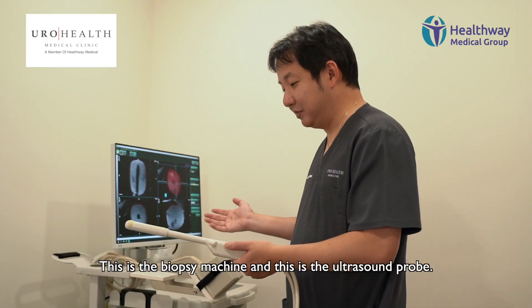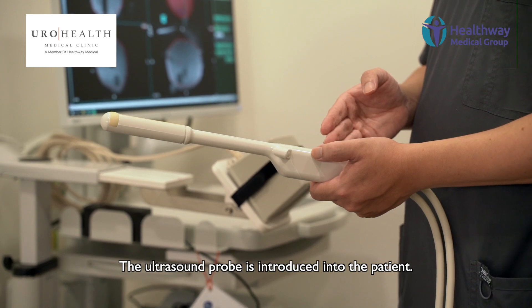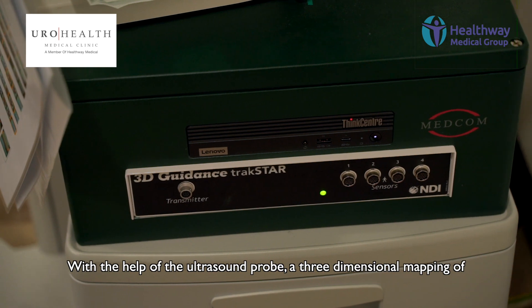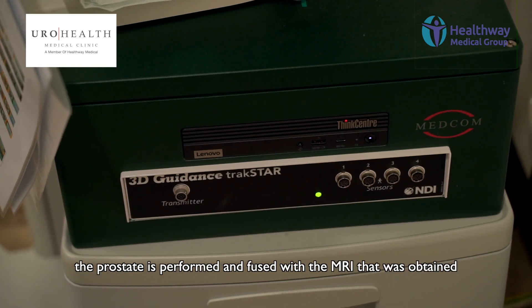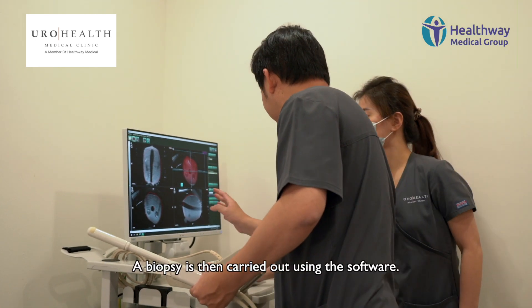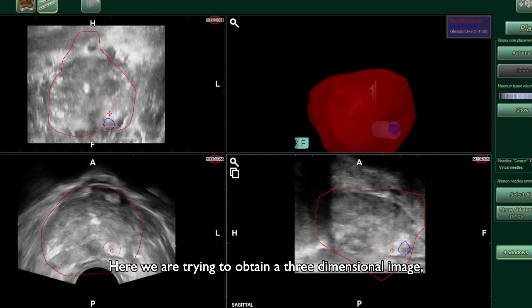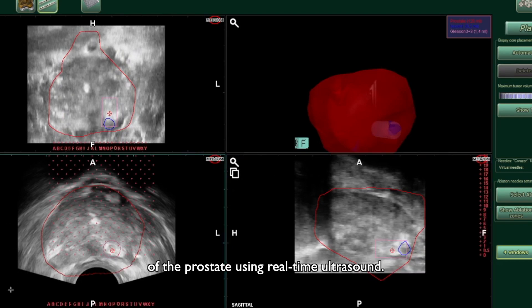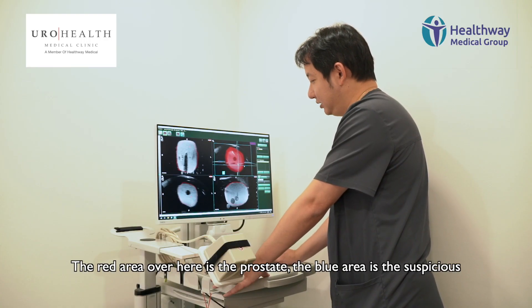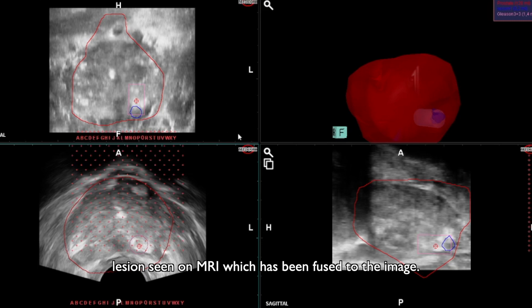This is the biopsy machine, and this is the ultrasound probe. The ultrasound probe is introduced into the patient. With the help of the ultrasound probe, a three-dimensional mapping of the prostate is performed and fused with the MRI obtained prior to the biopsy, carried out using the software. Here, we are trying to obtain a three-dimensional image of the prostate using real-time ultrasound. The large area shown here is the prostate, and the blue area is the suspicious lesion seen on MRI, which has been fused to the image.